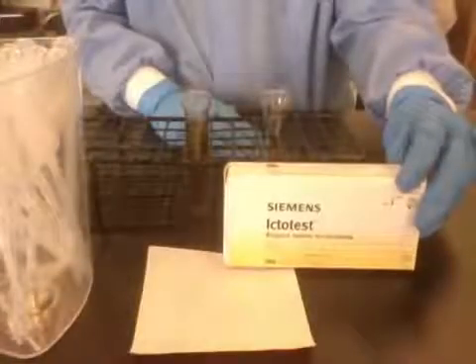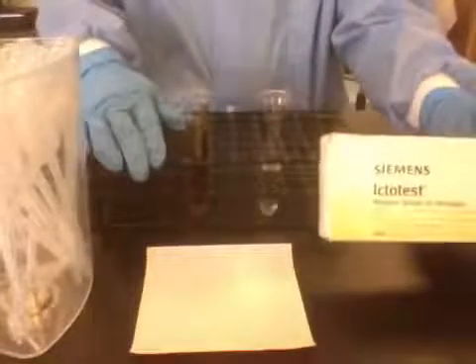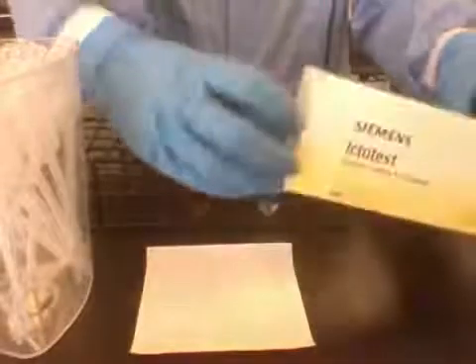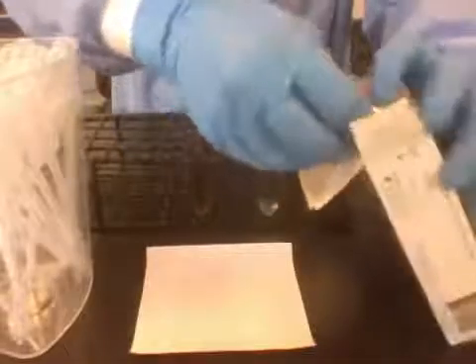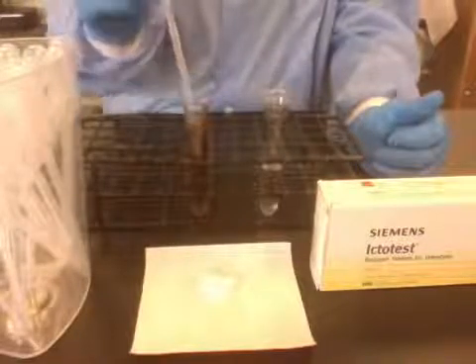The Ictotest is used for the confirmation of bilirubin in urine. To do the test, you need the kit, a specimen, and water. Here I have my labeled water and specimen. I'm going to open up my kit and remove an absorbent pad. First, you're going to add 10 drops of specimen to the absorbent pad with a transfer pipette.